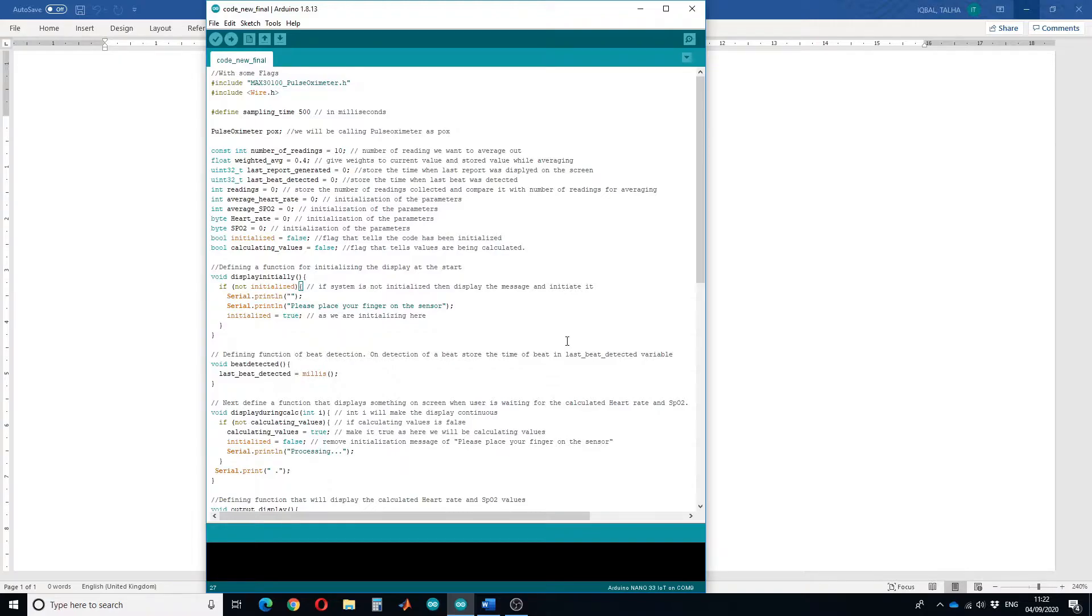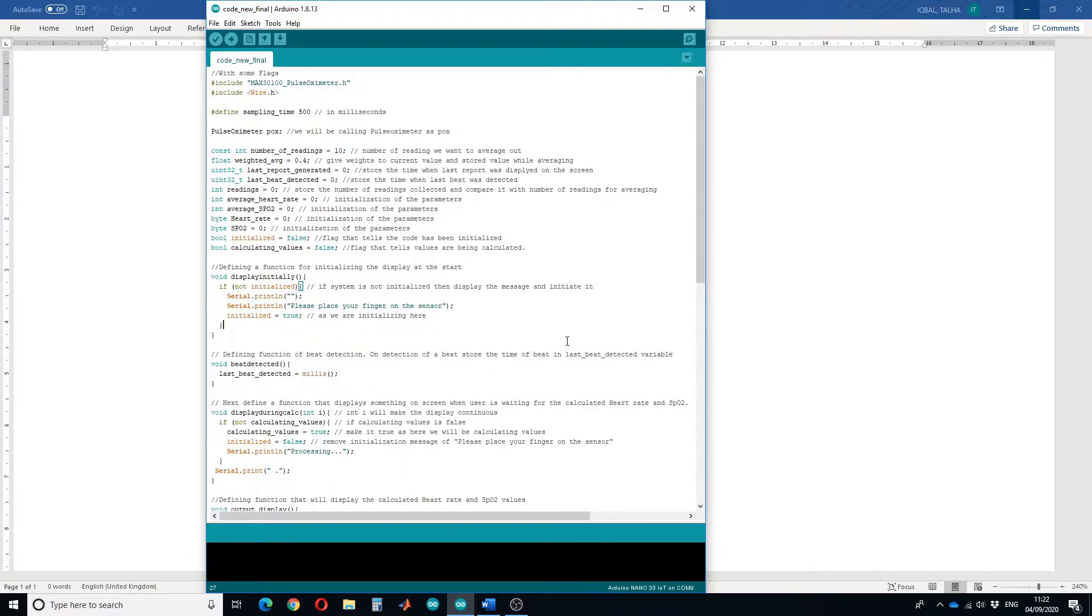In the previous video I showed you how you can design a simple heart rate monitor, but the values of the heart rate were jumping around and were not stable. So in this tutorial I will show you how you can design a stable heart rate monitor.